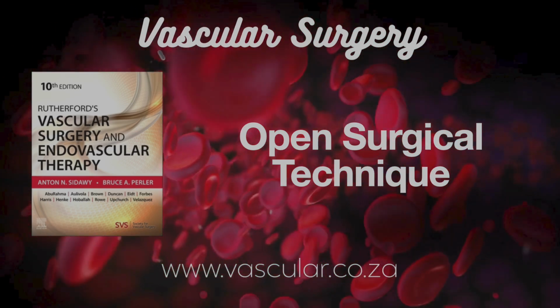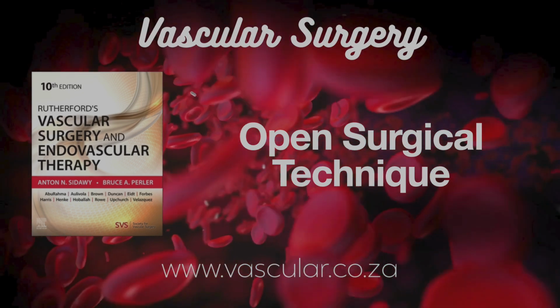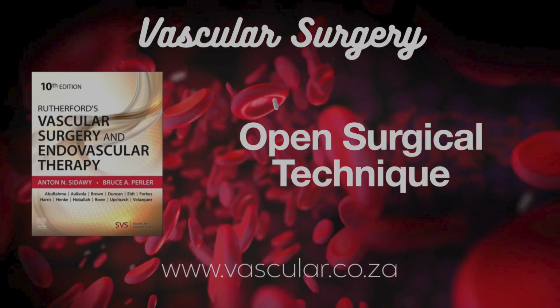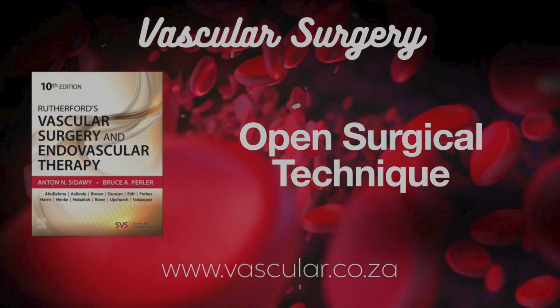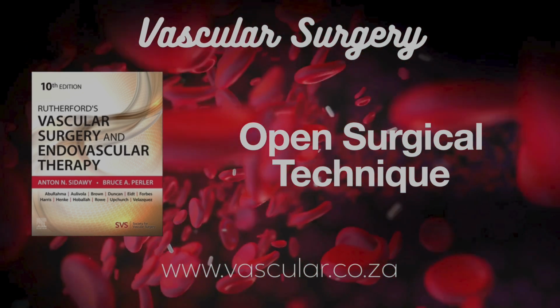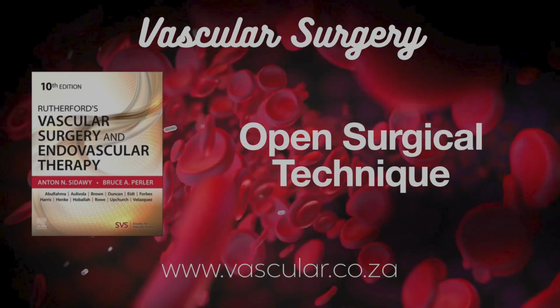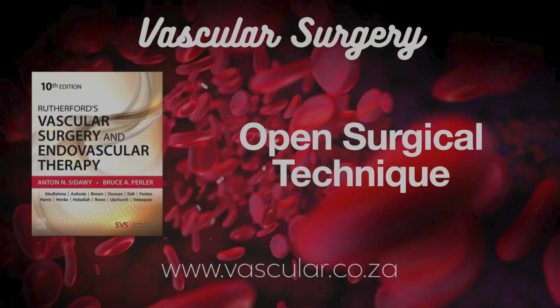Technical factors favoring a patch. Artery less than 5 millimeters, significant plaque at the site, jagged incision, tortuous artery, loss of wall area. Also non-technical factors like high risk for restenosis, hyperlipidemia, smoking, female, prior restenosis. Advantages of patching. Needle always goes inside out, avoids pushing plaque in, allows good purchase and patch an artery without compromising lumen. Need to choose appropriate patch width, though. Too wide causes redundancy, invites thrombus.